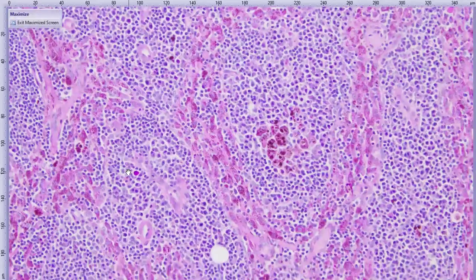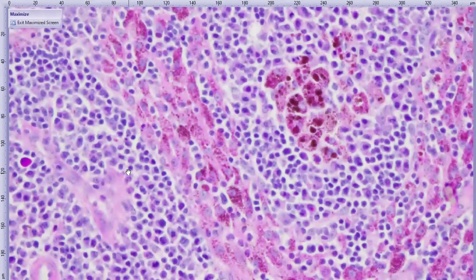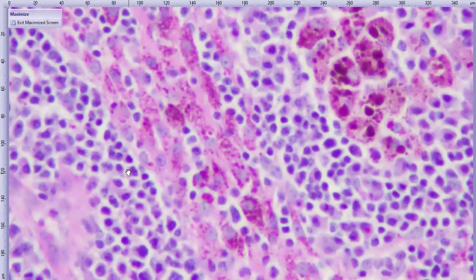And I really felt, wow, it's even more dramatic under the camera than it is on the microscope, but I really felt that all these cells, all in quotation marks, had a lot of PAS positive stuff in their cytoplasm. So I was like, okay, this is probably good news, because my bias right now is that these are macrophages, that they're not melanocytes.